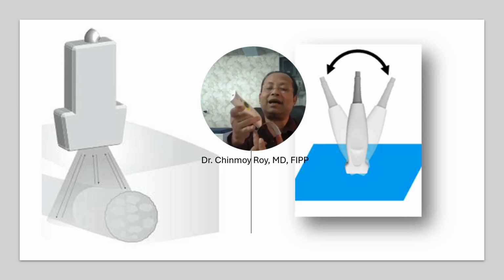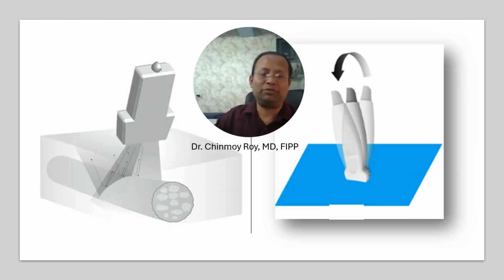So to see the whole structure, which is a rounded structure, we have to take help of this heel toe maneuver. So this is a heel toe maneuver to combat the anisotropy artifact in this situation. Okay, there is a possibility of another scenario in anisotropy.